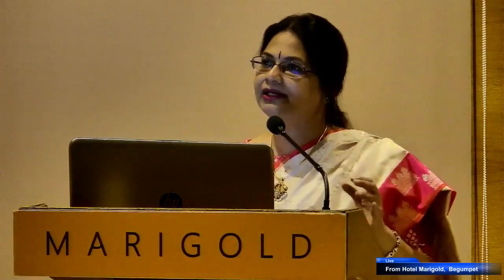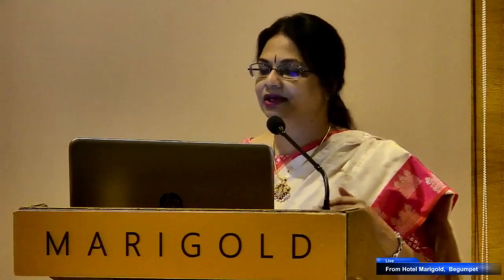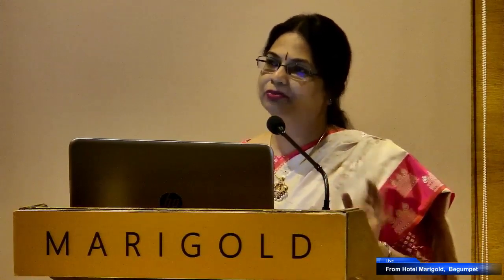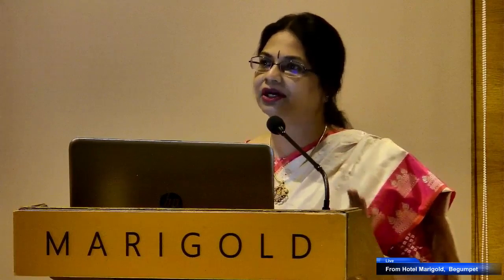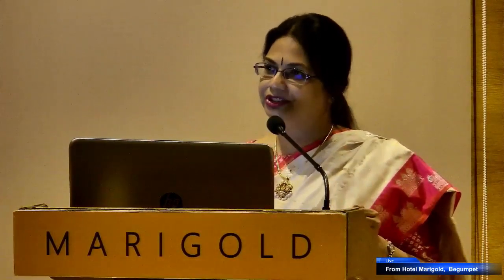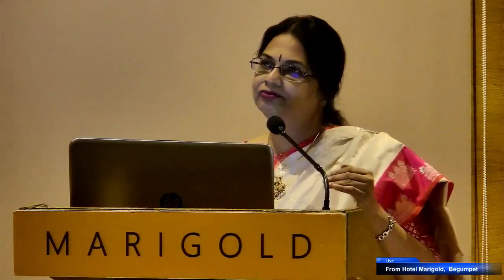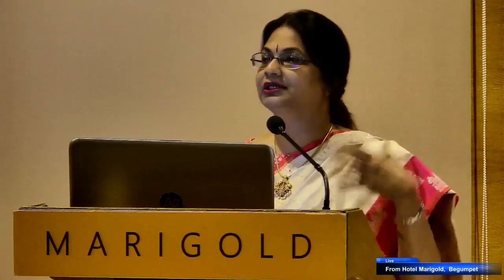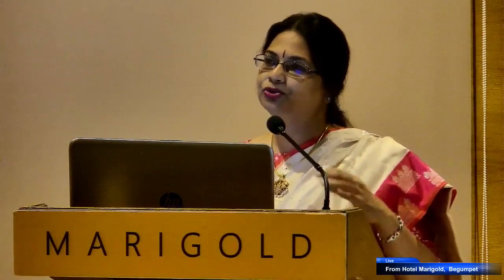Also, grading is important for us because it tells us what went wrong in the laboratory, and very good troubleshooting is possible when you sit and give some time for oocyte grading in routine practice. Yes, it is controversial because it is a subjective assessment, and today we know that a lot of money and a lot of effort has been put into time lapse and so many other mechanisms that we use in the lab to improve our outcomes.